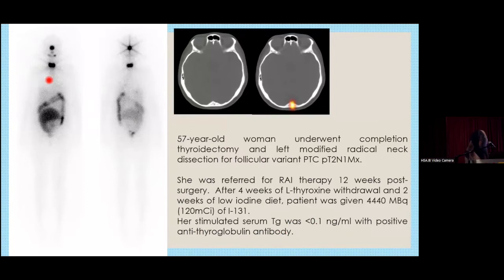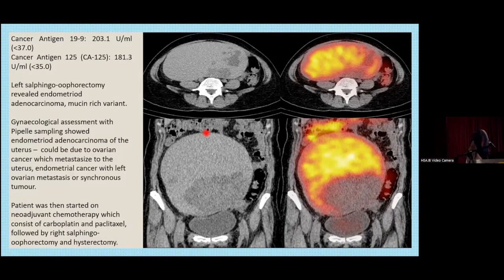So as you can see here, there is uptake somewhere in the skull area, and expected uptake in the neck, which could be thyroid remnants, but there's something not right here. So we did a SPECT-CT. Actually, from whole body planar, you can roughly gauge that this is uptake in the bone posteriorly because it's more prominent, and true enough, it's in the bone. And the uptake in the abdomen turned out to be a very large retroperitoneal mass.